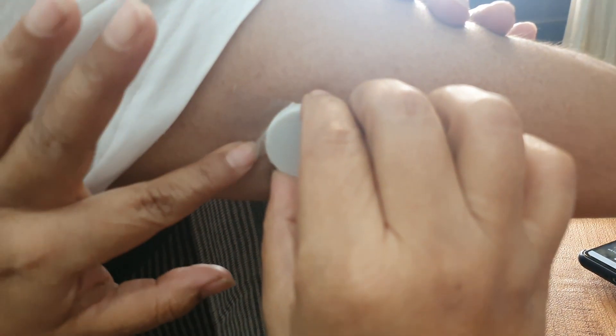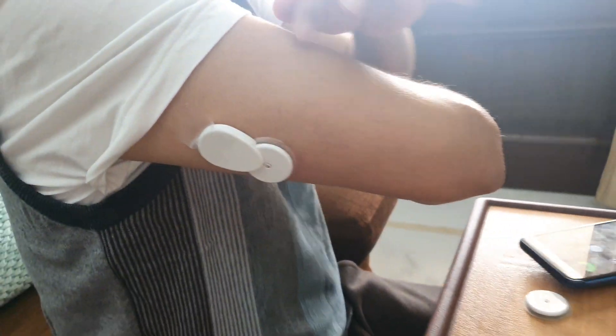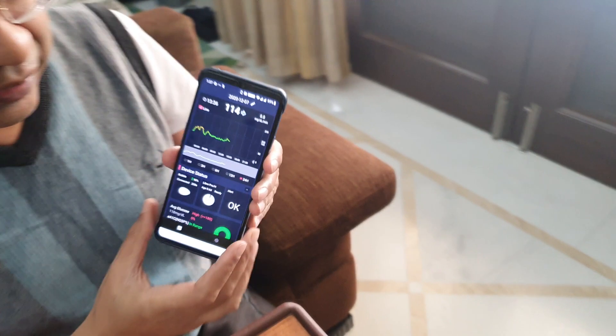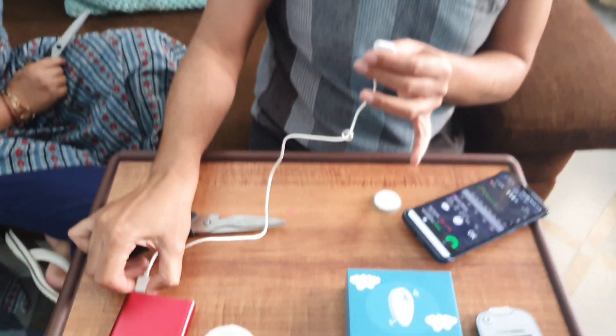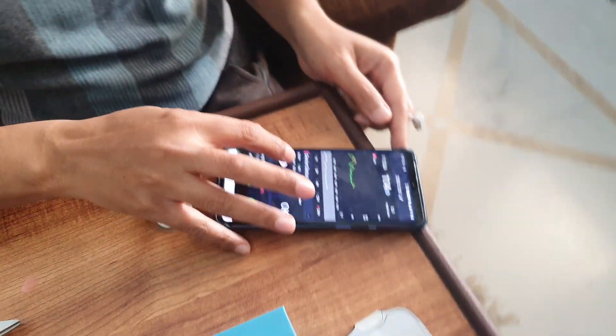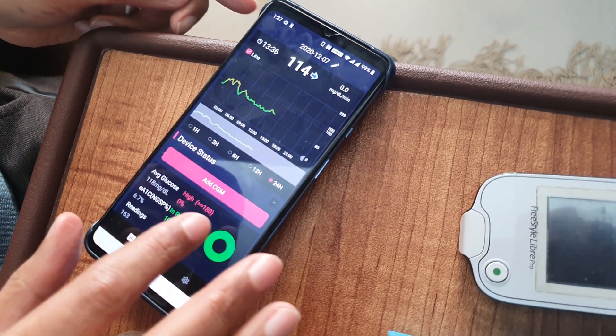As you can see, this is pretty straightforward and not very inconvenient — that is the easiest way to do it. In case you have trouble, there is a reset option: you can go into the app, forget the device, and then reset the Bubble sensor without taking it off.